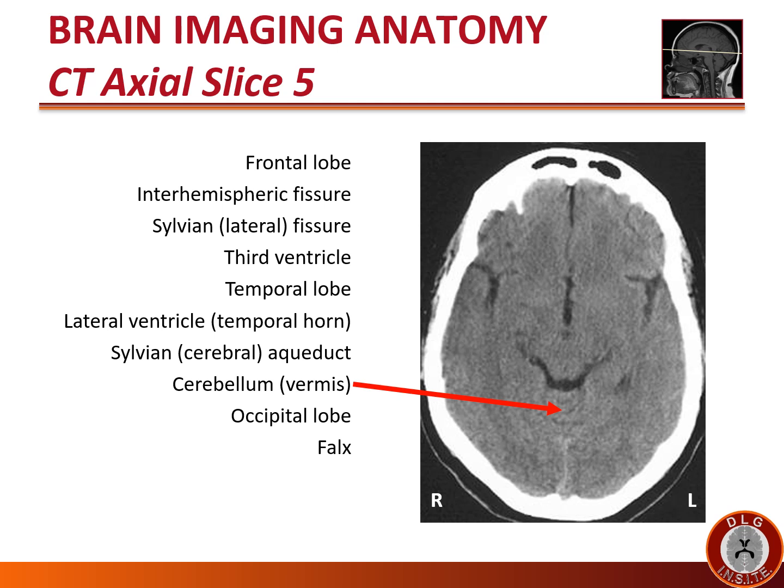We continue to see the vermis of the cerebellum right behind the quadrigeminal plate cistern. At this level we continue to see the occipital lobe behind the cerebellum. The wine goblet appearance tells us that the occipital lobe is there behind the cerebellum — the glass being the vermis and the stem being the hyperdense meninges or falx between the two occipital lobes. Here we see the hyperdense dural structure called the falx between the two cerebral hemispheres, which looks like the stem of a wine goblet at this level.